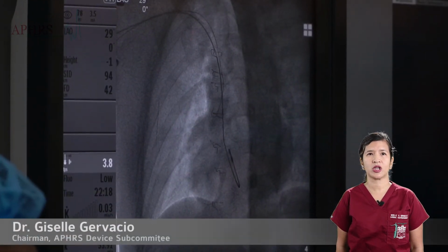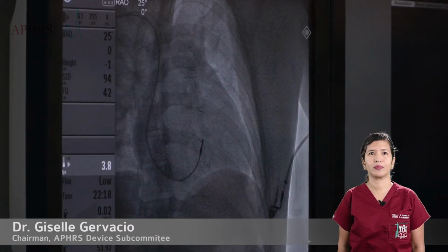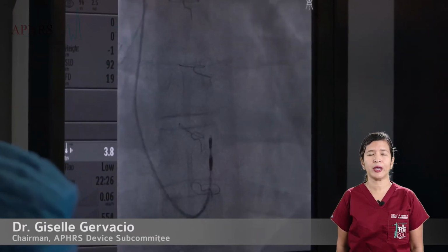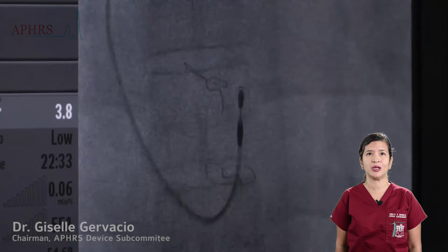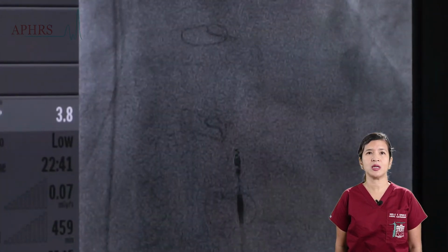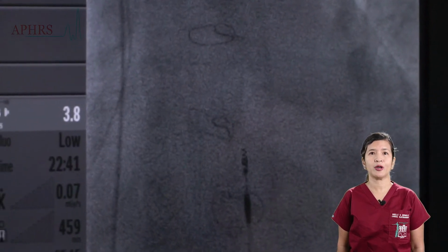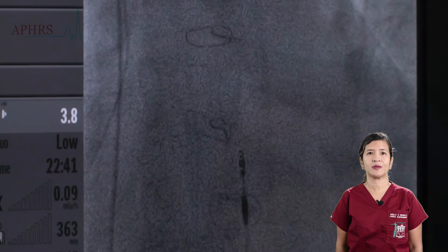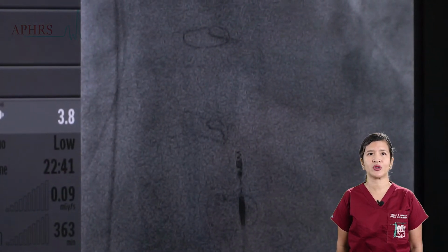The image is checked on both RAO and LAO views. The screw is then deployed by turning the pinching tool several times and visualizing the image using a magnified view. One will see the screw being deployed and the separation of the metallic part of the end of the lead into 2 parts, confirming full deployment of the screw.